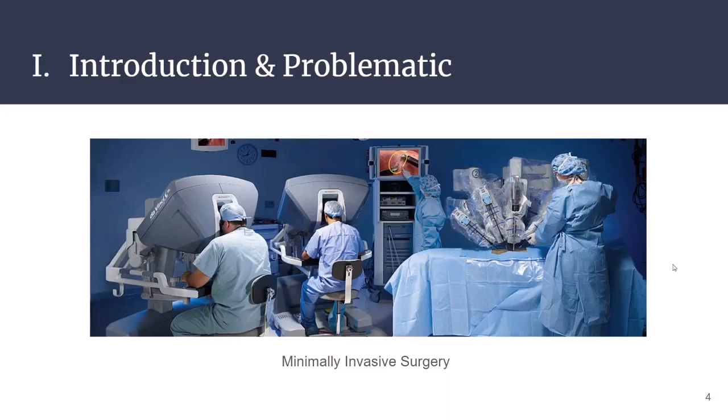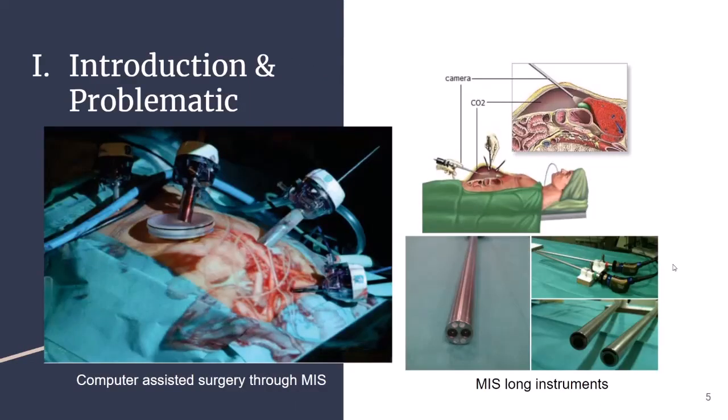These sticks act as the hands and actions of the surgeon through a robot that he's controlling directly. These sticks generally look something like this. They use CO2 to inflate the abdomen to make the management of the sticks a little bit easier, and it generally means a faster recovery for the patient and less pain.